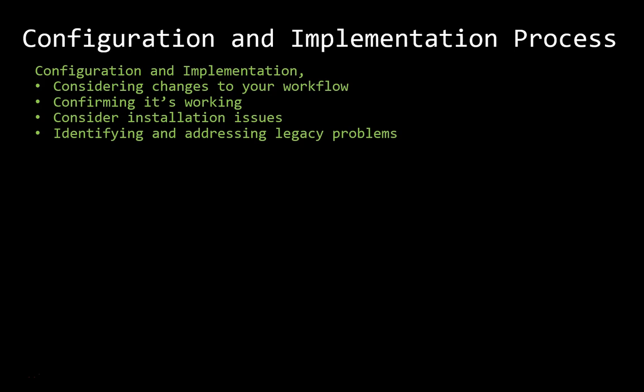But consider how much easier it would be to run through the 9 IHE recommended tests, since you're connecting 2 IHE compliant systems, than if one isn't. If one's not IHE compliant, then you have to develop your own test to test every possible function, and you just don't want to go down that road.